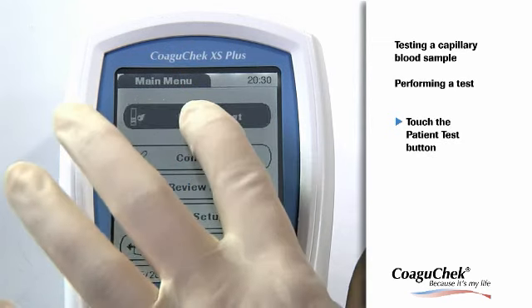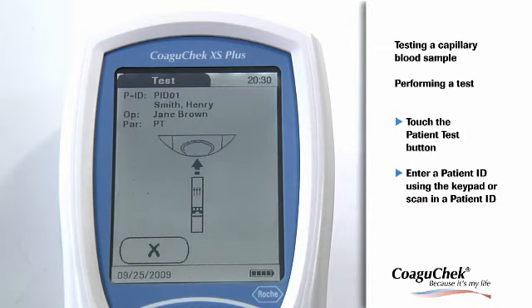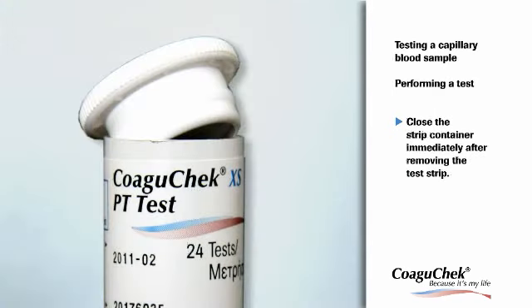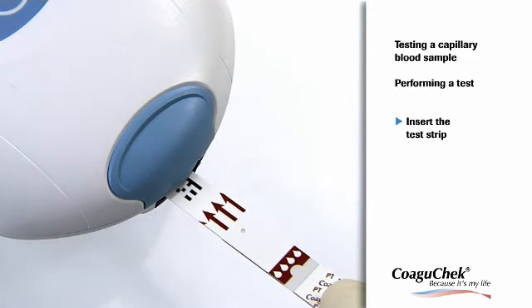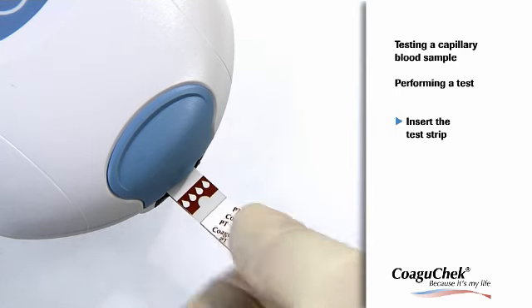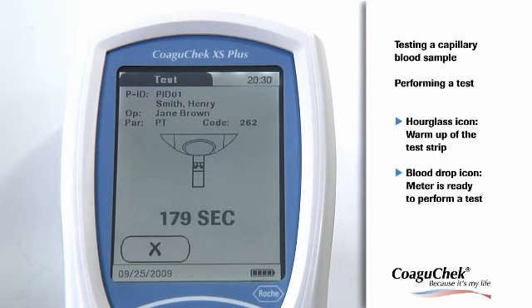Touch the Patient Test button or select a patient from the patient list. The New button can be used to enter the ID through the keypad. The test strip icon prompts you to insert a test strip. Remove a test strip from its container and close the container again immediately with the stopper to prevent damage to the strips. Hold the test strip so the lettering is facing upward and slide it into the test strip guide. The hourglass icon shows that the test strip is warming up. Then the blood drop icon flashes to indicate that the meter is ready to perform the test and is waiting for blood to be applied.